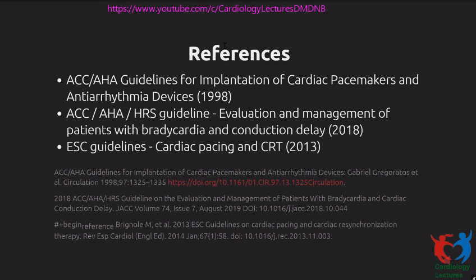On Holter you classically see short episodes of atrial fibrillation, and when the atrial fibrillation stops, they can have asystole lasting 8 or 10 seconds, and that causes the symptom. So a patient with tachy-brady syndrome tends to get a pacemaker more often compared to somebody with an isolated bradycardia.